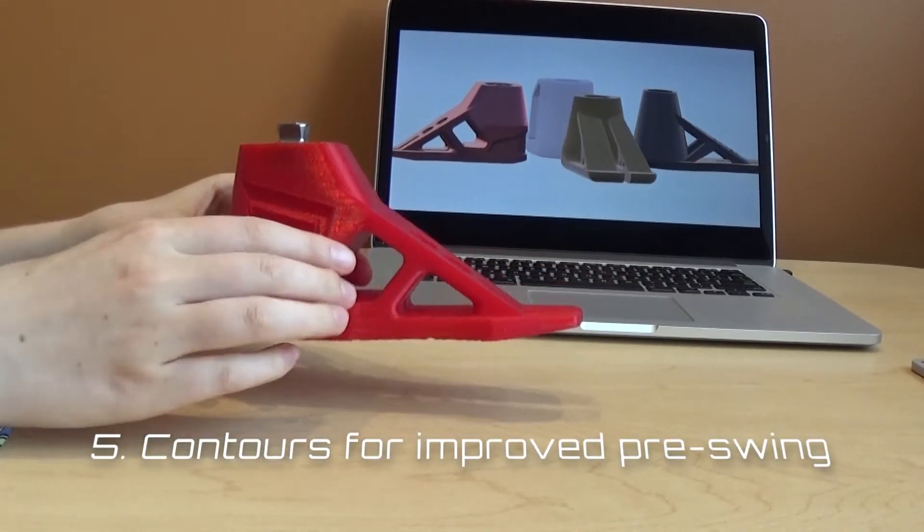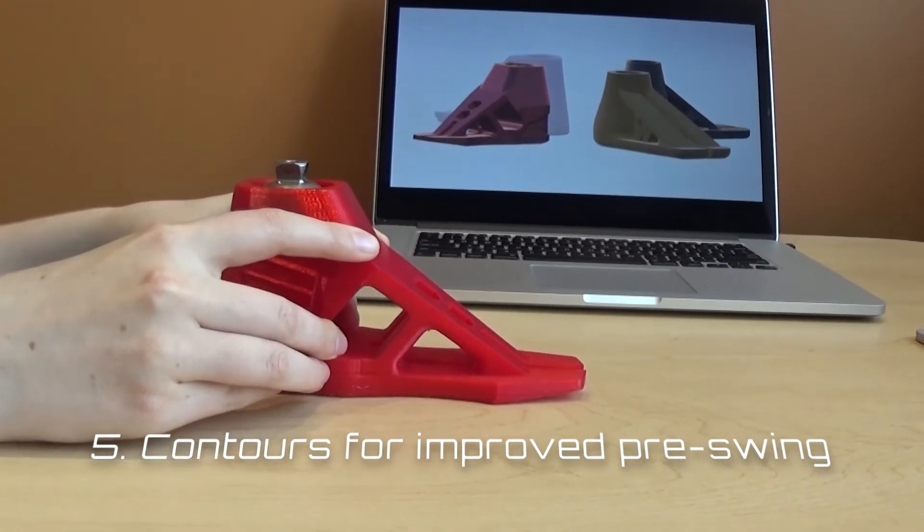Fifth, a rounded toe allows the prosthesis to rock forward to better prepare for pre-swing.